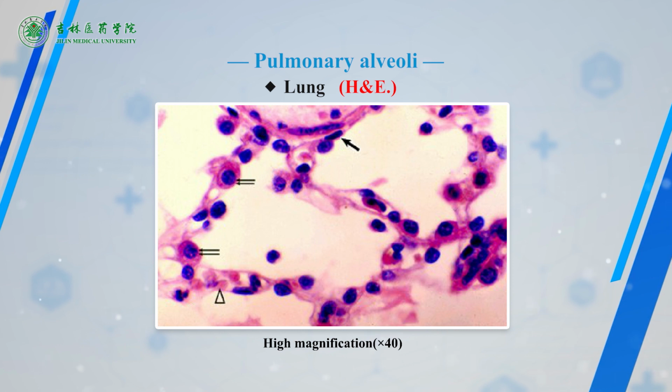We sometimes see that the pulmonary macrophage is large with a round nucleus in the center. Its cytoplasm is stained red and filled with numerous engulfed dark brown granules.